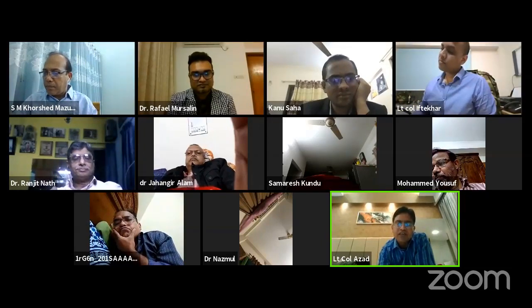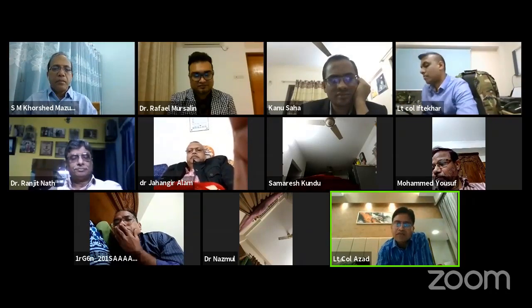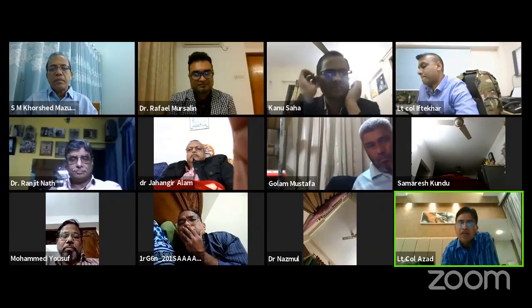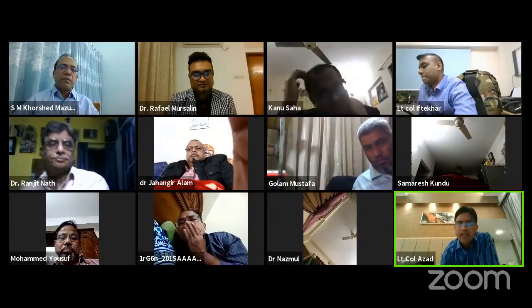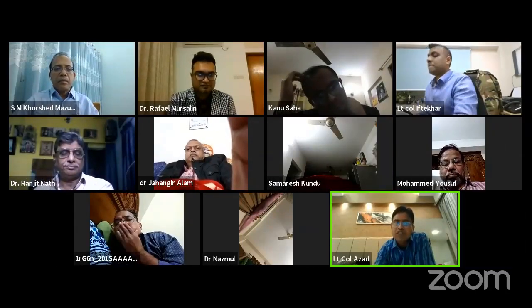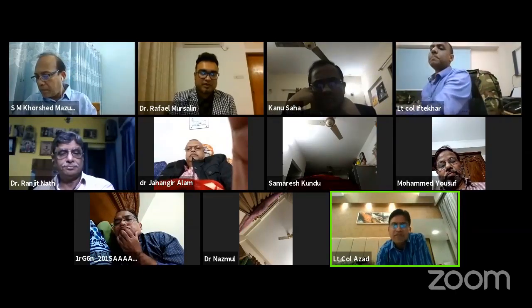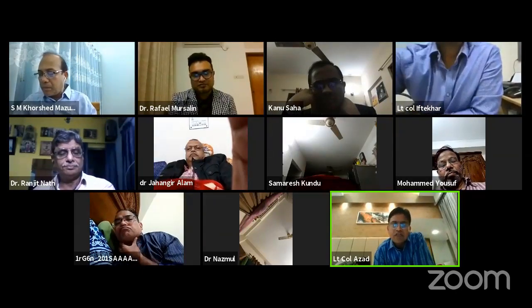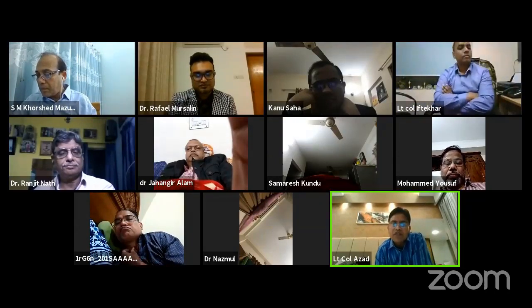Few things remained untouched, like oral cancer and tongue cancer. Already Professor Yusuf sir has mentioned, in tongue and floor of the mouth, MRI is the only thing, because in tongue cancer, the third dimension you have to know by MRI. Other than that, it is not possible to see the third dimension. And in laryngeal cancer, CT scan is better, but for problem solving like subtle cartilage erosion, MRI is the problem solving tool.